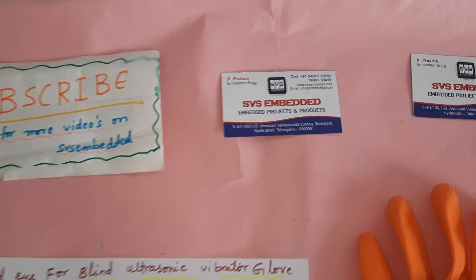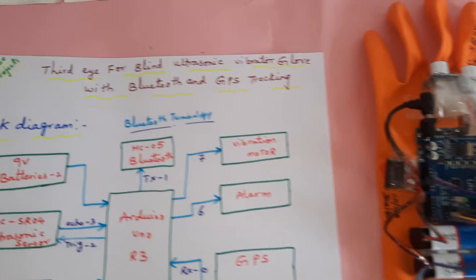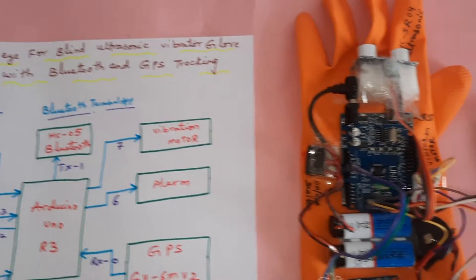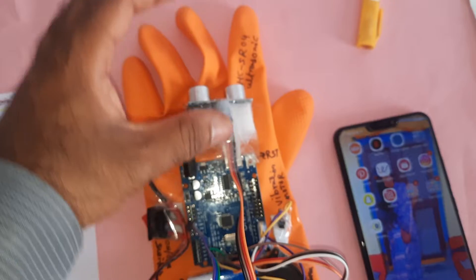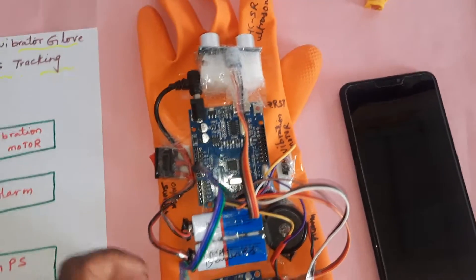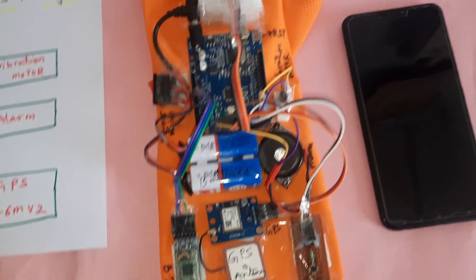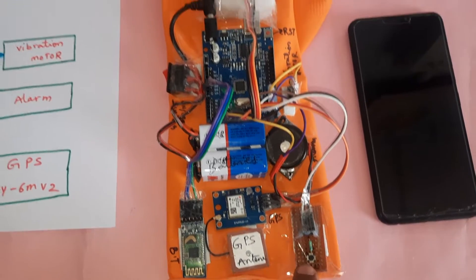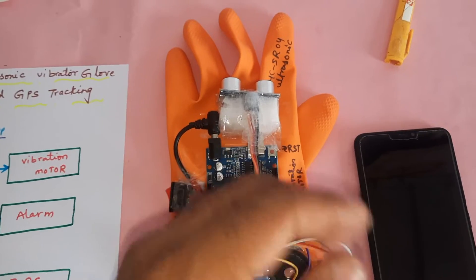Hi, we are from SVS Embedded. The project title is 'Electronic Third Eye for Blind - Ultrasonic Vibration Glove with Bluetooth and GPS Module'. We are using HC-SR04 ultrasonic sensor to measure the distance of the obstacle, Arduino Uno R3 board, 9-volt batteries, vibration motor, alarm, Bluetooth module, GPS antenna, GPS module, and one switch button.